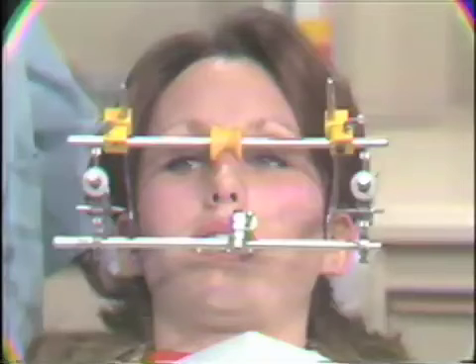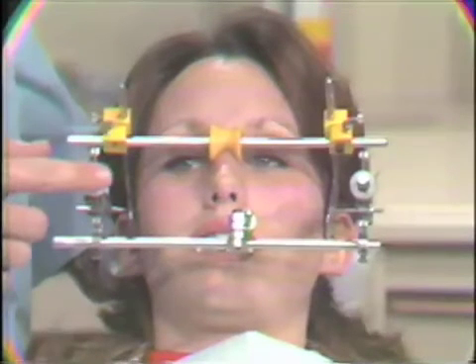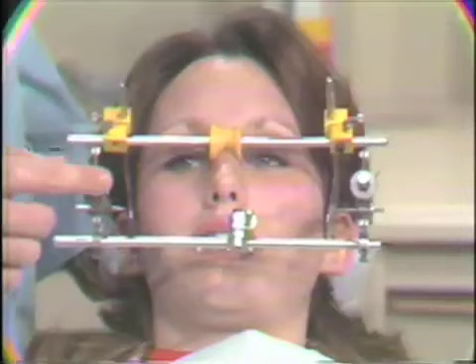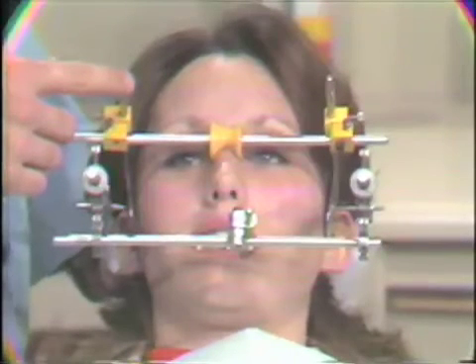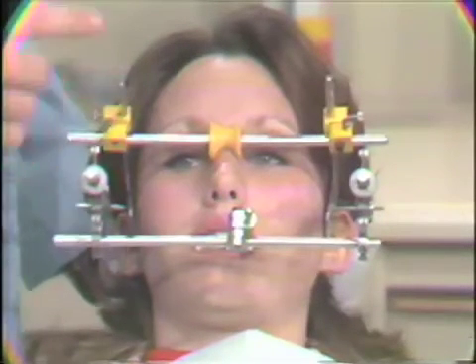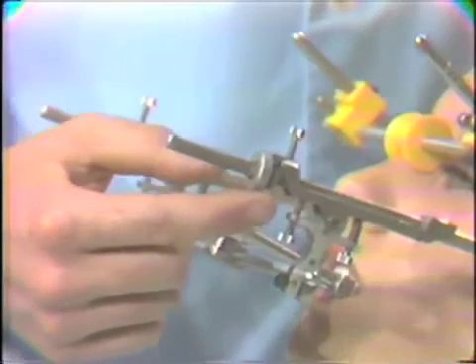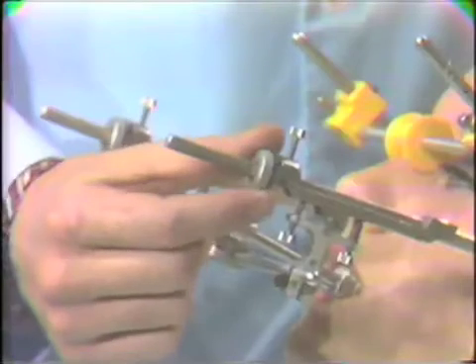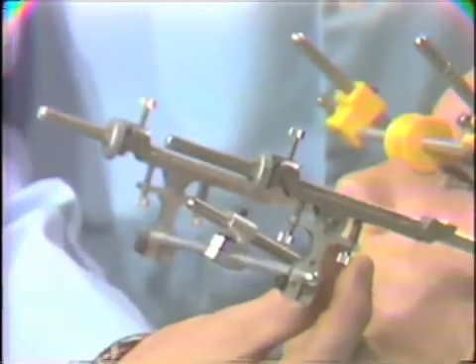Now we have the entire hinge axis locator assembled. We have the lower member attached to the universal clutch, which is attached to the mandible, and the upper member, which just fits like a pair of glasses over the bridge of the nose and over the ears, and is attached behind the ears by a rubber band. The lower member has adjustable sidearms, so you can adjust to move the pointer forward and back with this adjustment, and you can move the sidearm up and down by using these two adjustments here.